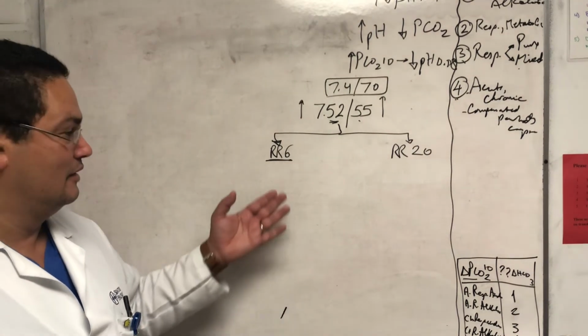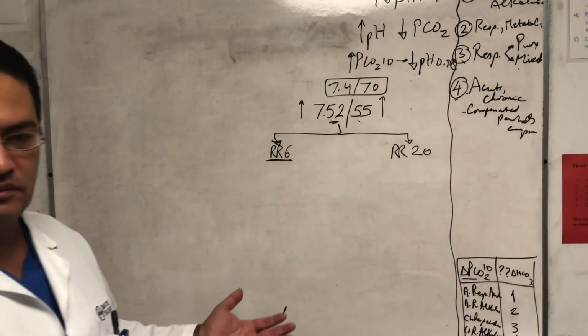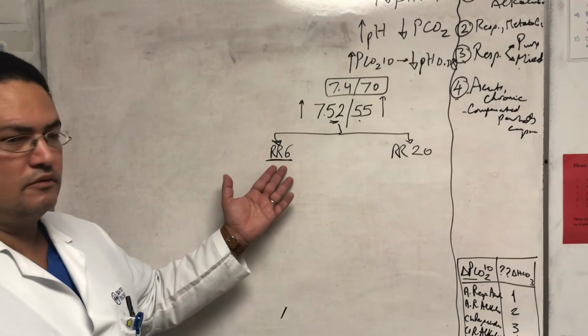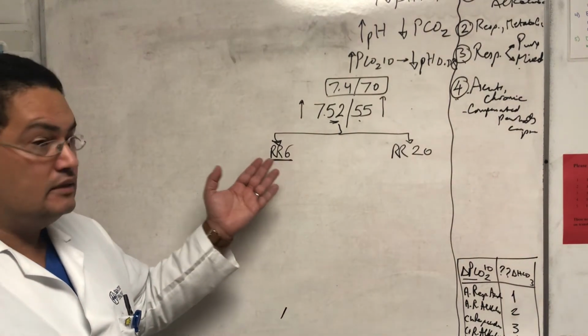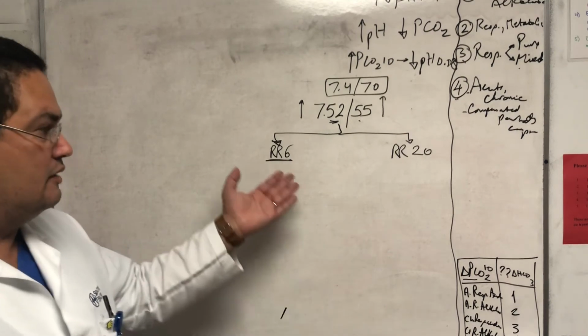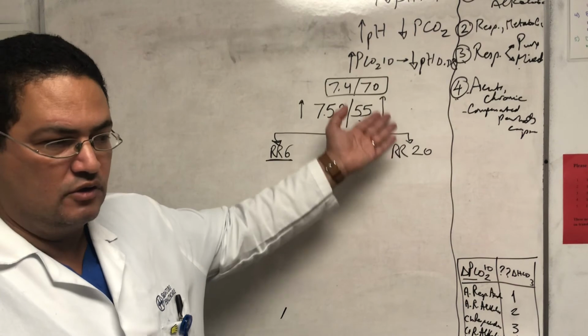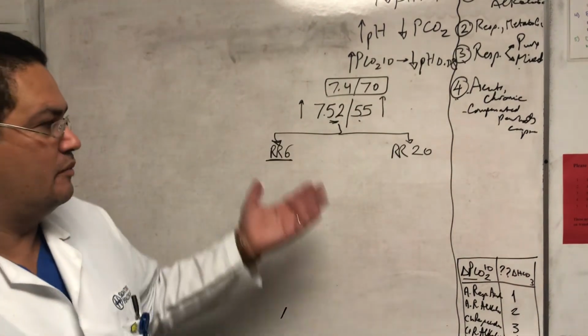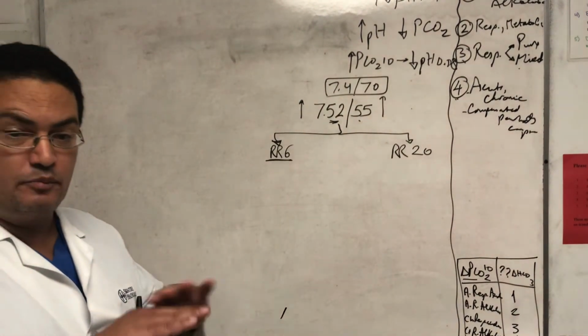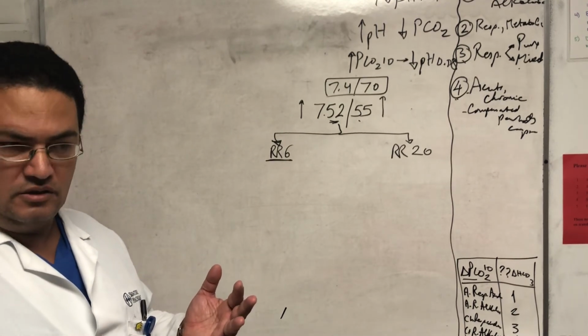Nobody does that. So there is obligatory some breathing, like respiratory rate of 4, respiratory rate of 6, something like that. Right? So respiratory rate of 6, he did what he can. He dropped his respiratory rate to 6, but his lungs are so healthy that even with respiratory rate of 6, he could only accumulate from 40 to 55 PCO2. So that's the maximum compensation. This is a pure acute metabolic alkalosis, partially compensated by respiratory acidosis.